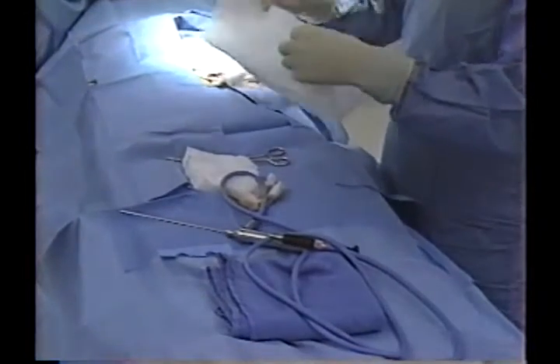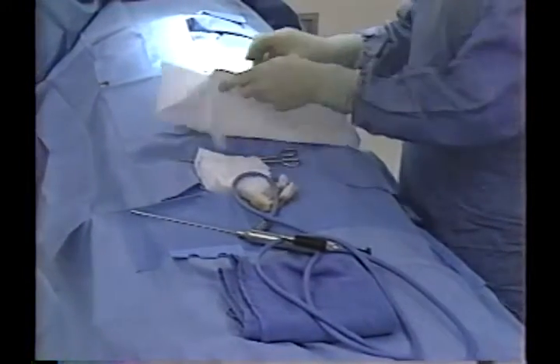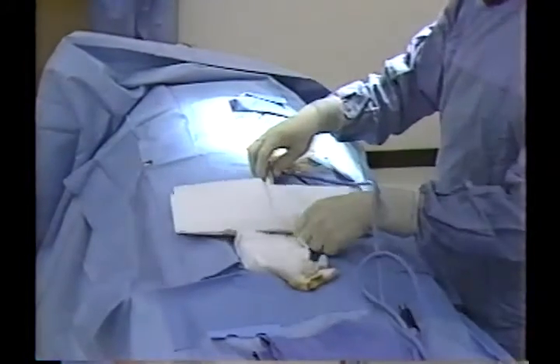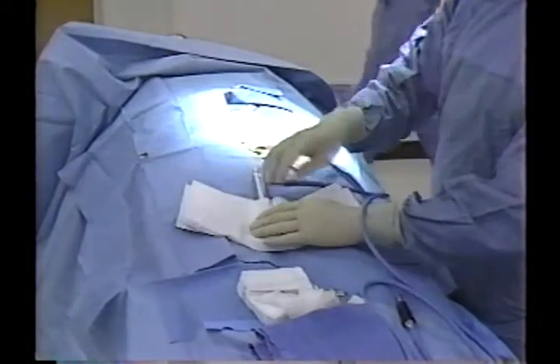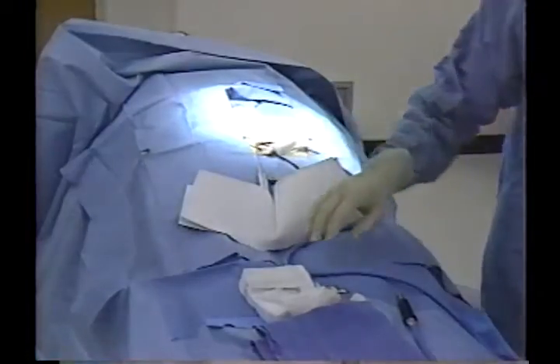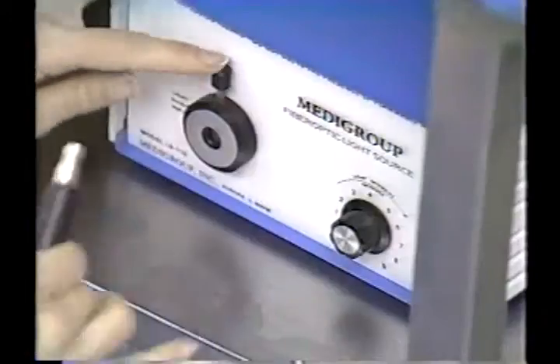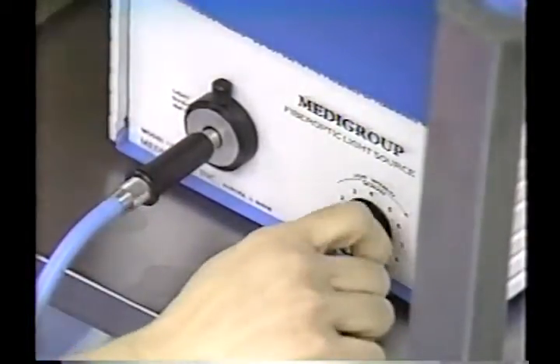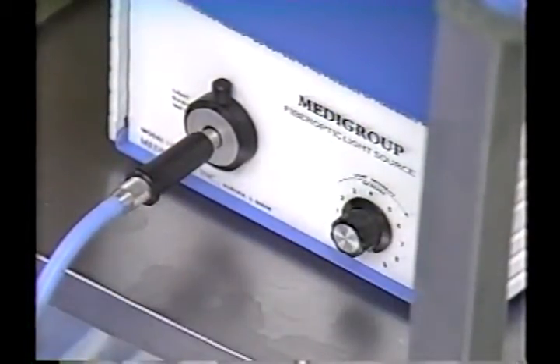The needle scope eyepiece drape is opened to cover the eyepiece to prevent contamination of the sterile field. The proximal end of the light guide is handed to the assistant, who inserts the guide into the light source. The assistant turns the light intensity dial to 7 or 8.